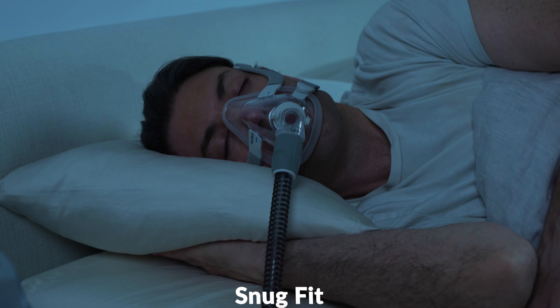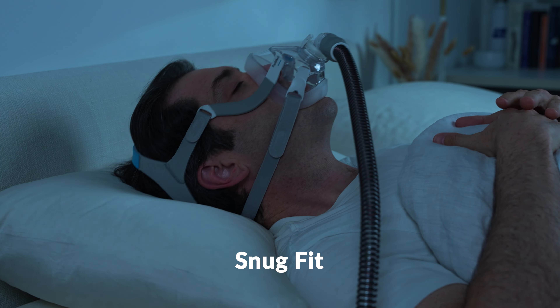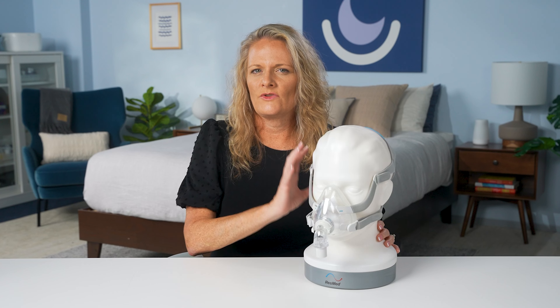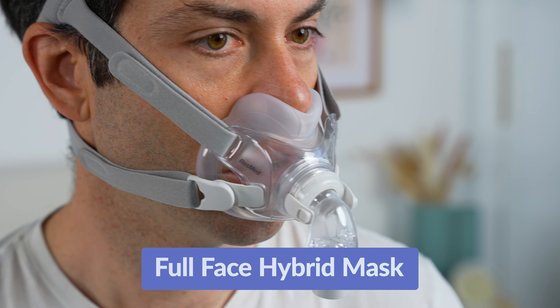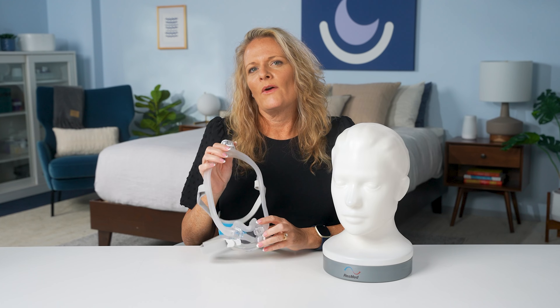The full face mask has many benefits and some drawbacks. People who use these masks can withstand higher pressure settings, and it comes with a variety of sizes to fit each facial type. It provides a snug fit with additional straps for a secure connection that doesn't move much during the night. However, the robust straps can feel cumbersome, and it may cause sensitivities on the bridge of the nose and other parts of the face.